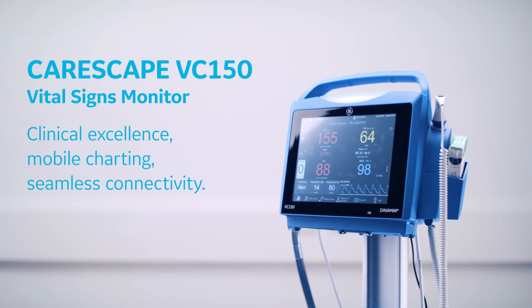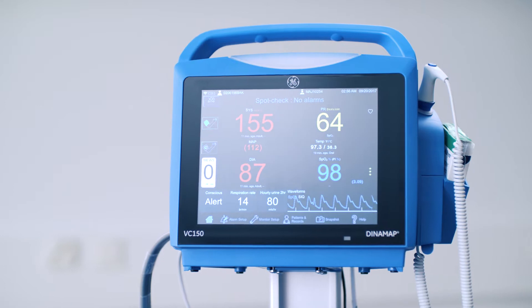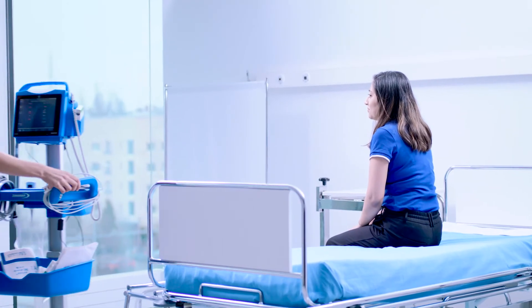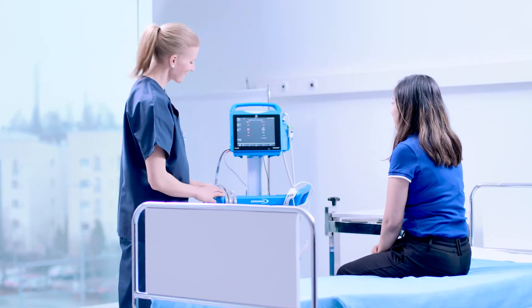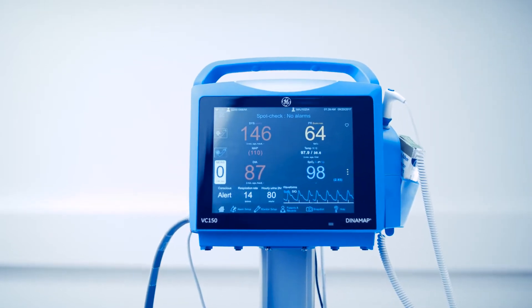CareScape VC 150 Vital Signs Monitor helps you manage patient information by collecting the right information at the point of care. It is a small, portable, easy-to-use monitoring alternative for site of care or during intra-hospital transport, intended for use for adult, pediatric, or neonatal patients.